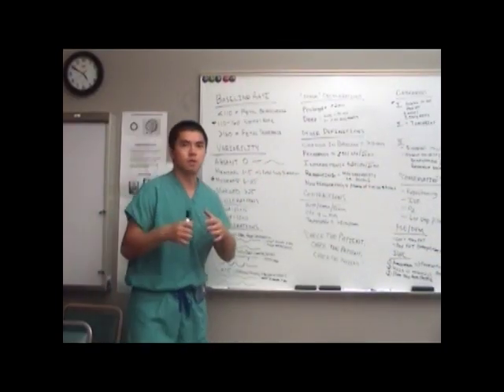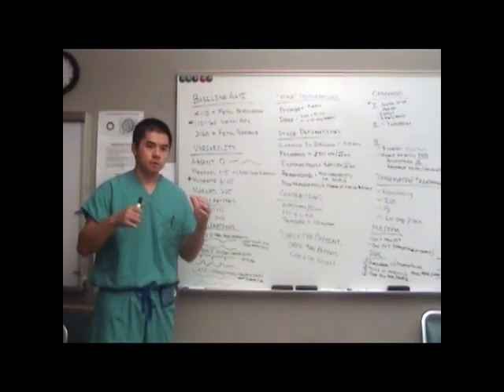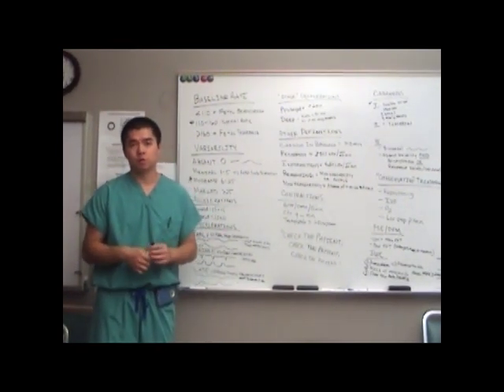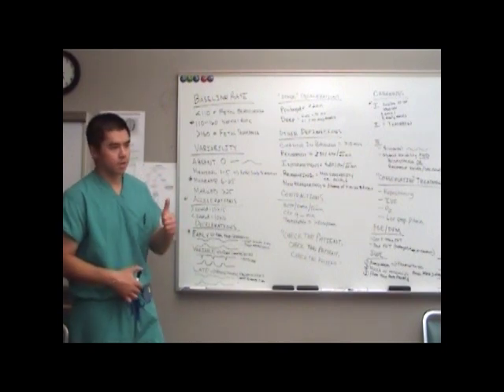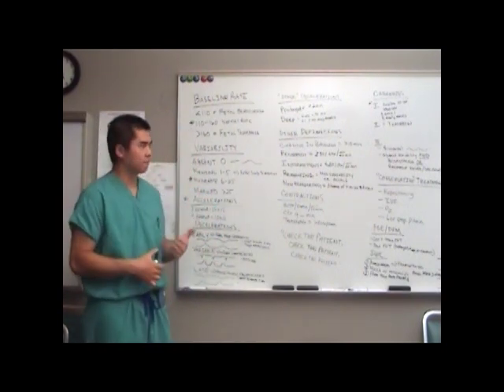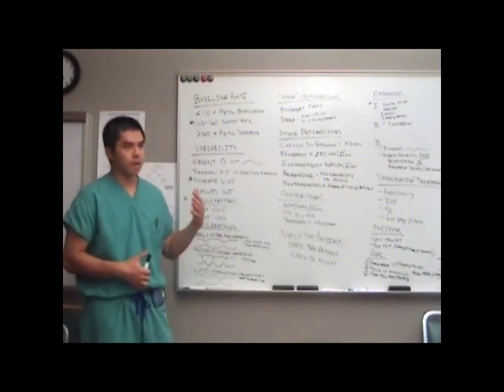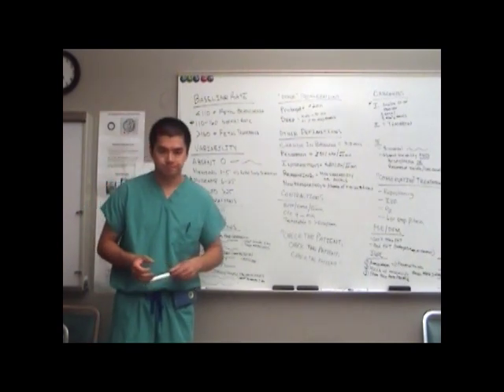Again, just to review and hit on some of the high points. So again, fetal monitoring has been shown only to increase your C-section rate, but it's the world that we live in, and it's the standard of care that we have. So it's important to know definitions, how to describe them, and also how to interpret them and how to address them and treat them.